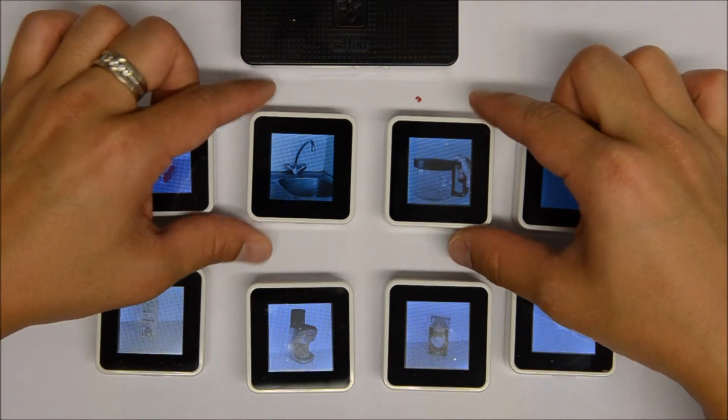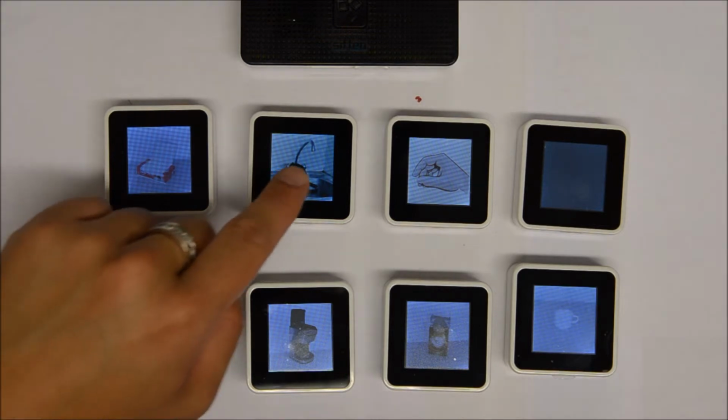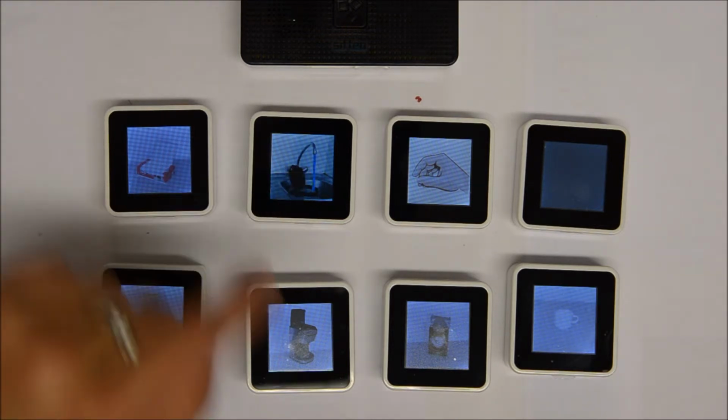First level reminder. Second level reminder, speak out the audio with flashing cubes. That means 2 cubes are going to be interacting. Third level reminder, it will not use a different audio. It will say connect the 2 cubes. And the fourth level will actually do the action itself, so we can keep moving on with the next steps. So the next, Ouvrez le robinet.